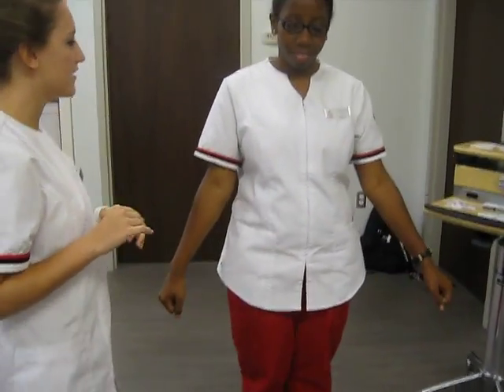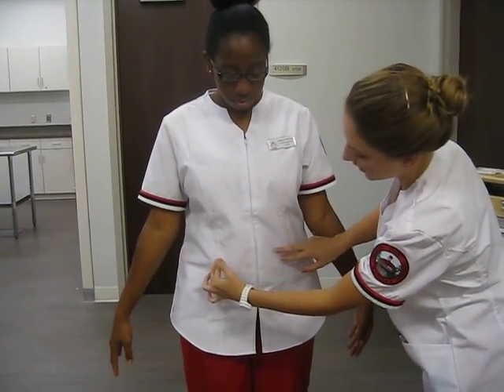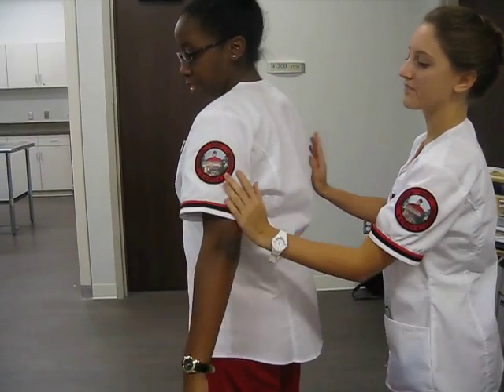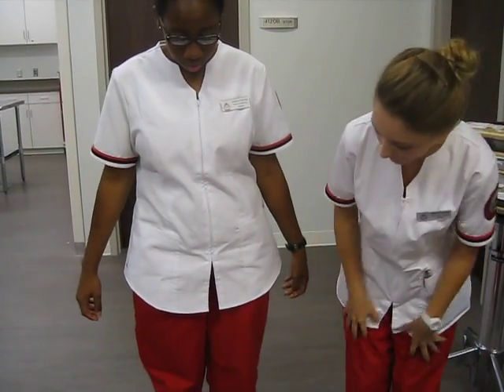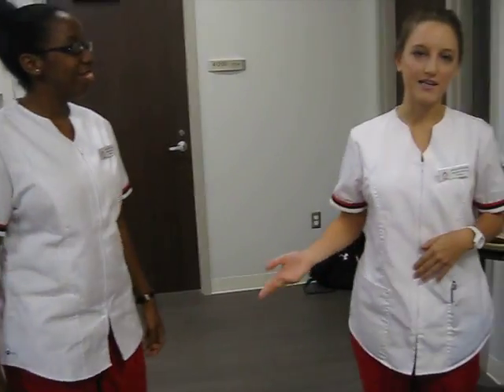Now for the subcutaneous, we are going to have two inches away from the umbilicus, on each side, upper and lower quadrant, and the backs of the arms, the upper back, the lower back, and the adipose tissue on the top of the thighs. And those will be our sites.